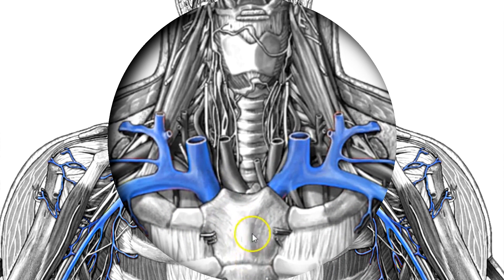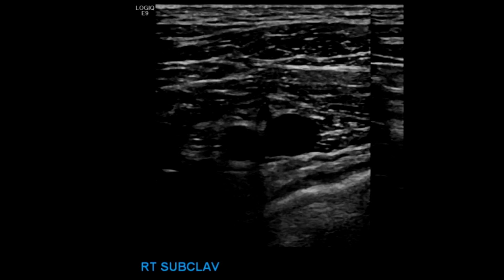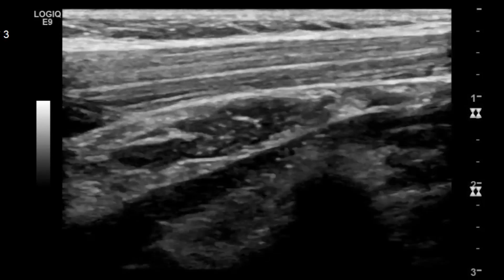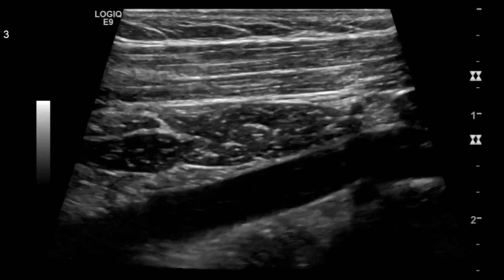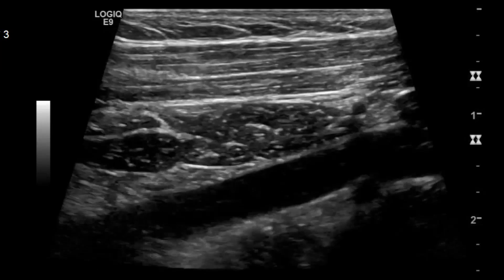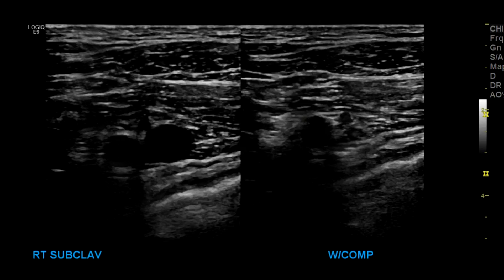After the jugular, we do the subclavian. Here you see both subclavian vessels on either side; the superior vena cava is right here, these are the brachiocephalics, and the jugular goes this way. For the transverse view of the subclavian vessels, put the probe in the longitudinal orientation on the chest wall. You will also see respiratory variation here, and you may or may not be able to compress this vessel depending on the muscles.